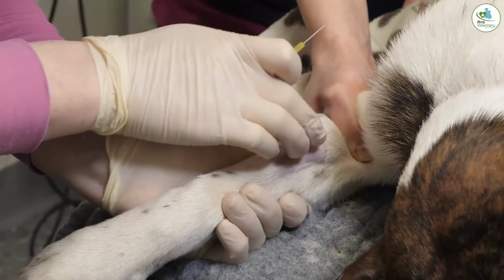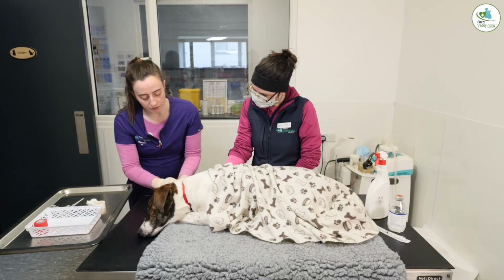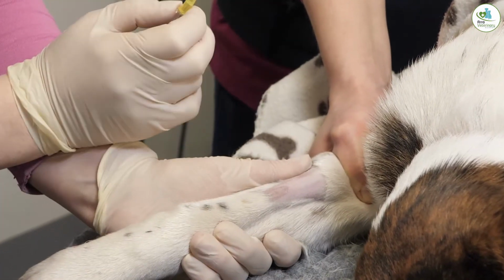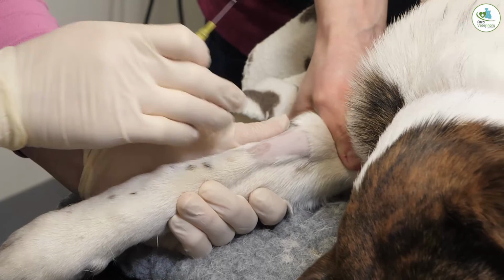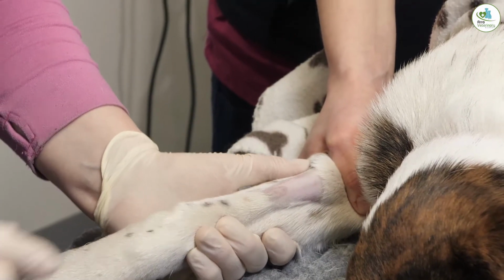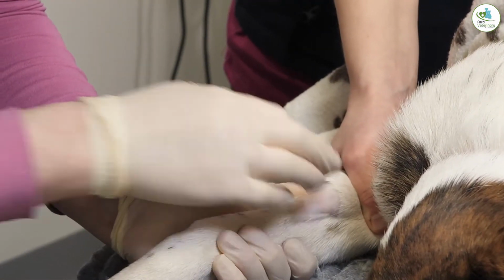So you find your vein. If you're not sure where the vein is, don't go in. If you want to have a feel, we can feel the vein nice and raised here, but if you're not sure, what you can do is you can ask the person that's helping to release it, and when they release it, that will flatten again, so then you know you're in the right spot. So we get it back up, and again, if you're not really feeling it coming up properly, if you do a little bit of movement like that, it can help fill the vein as well. So we're getting a nice vein coming up here.